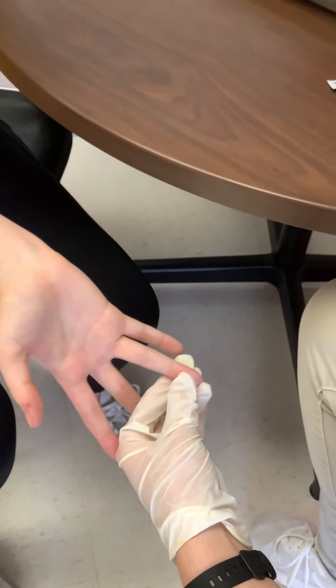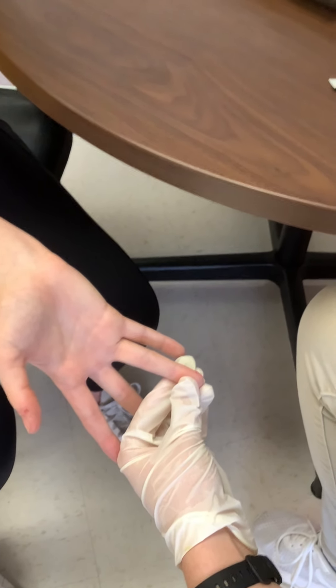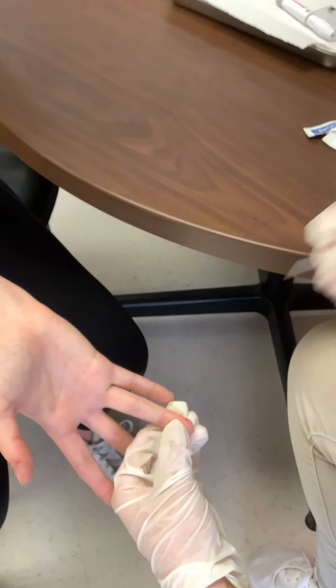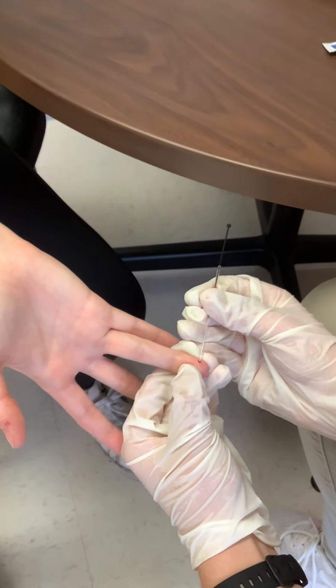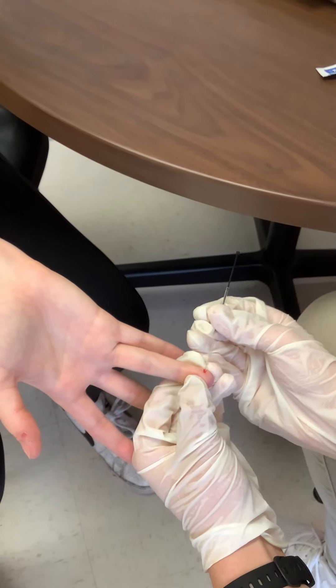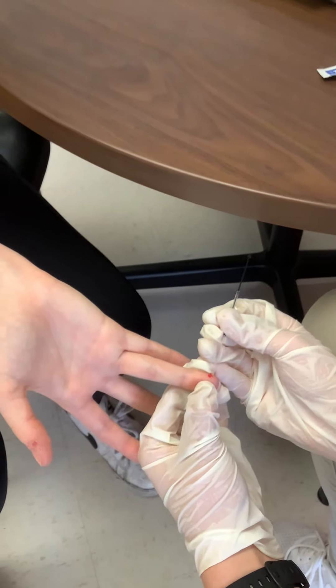Then you're going to quickly grab the capillary tube with the plunger. Make sure the plunger sticks in. Squeeze out. Try to go in at a side angle. Don't be afraid to apply lots of pressure.